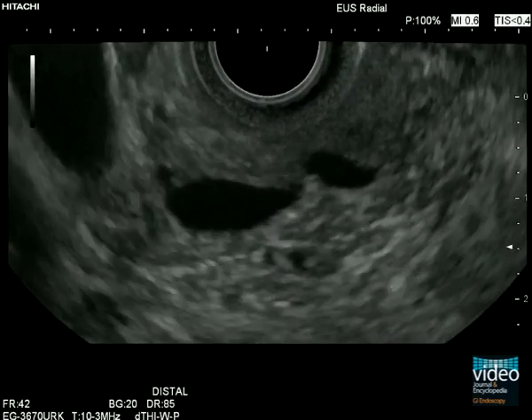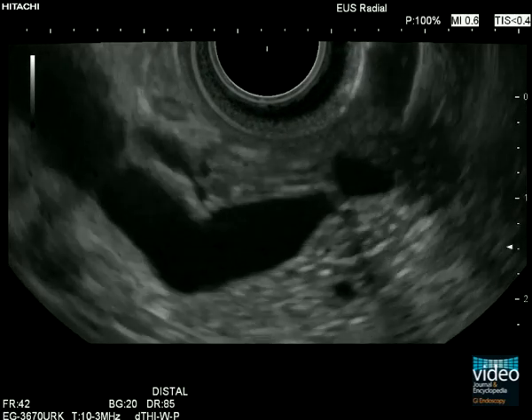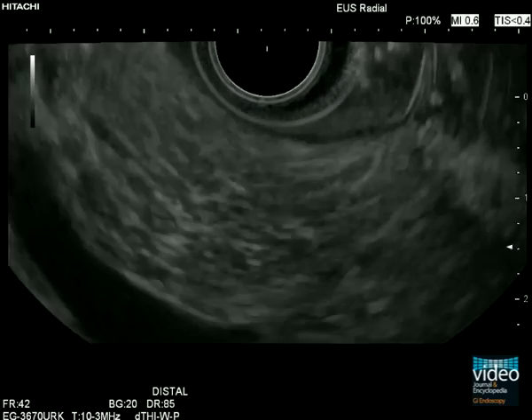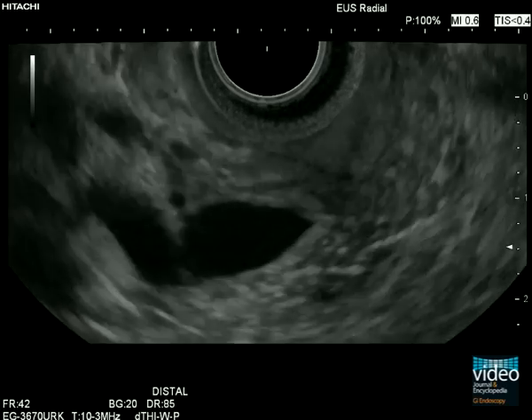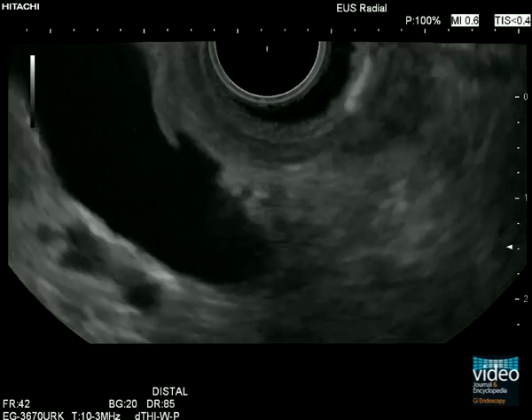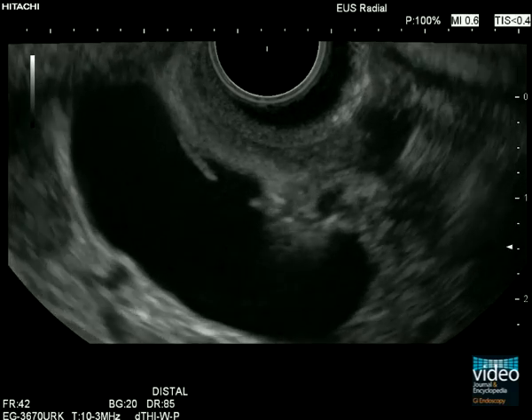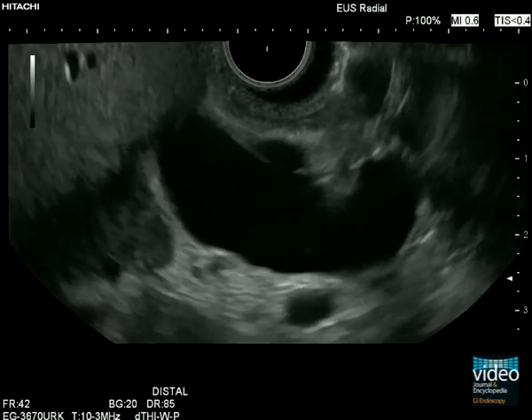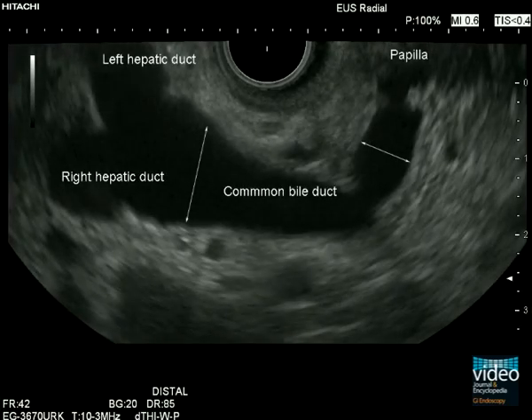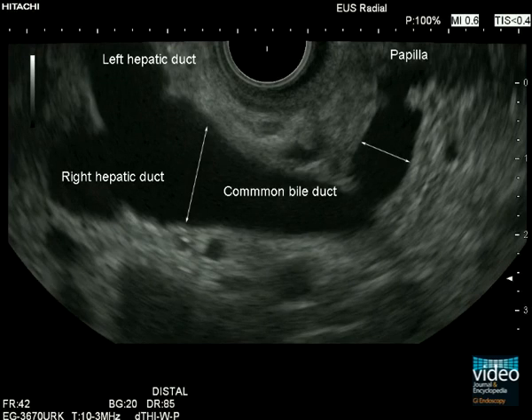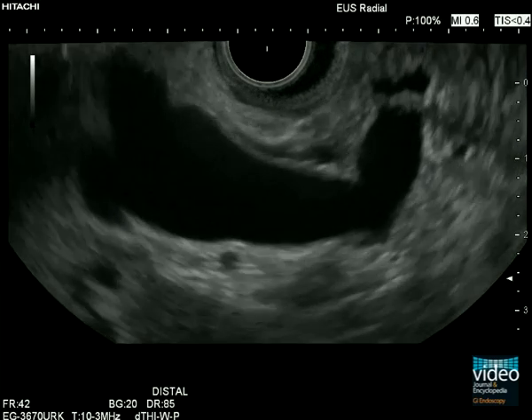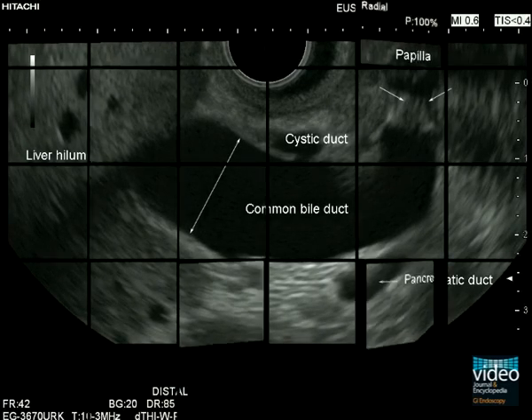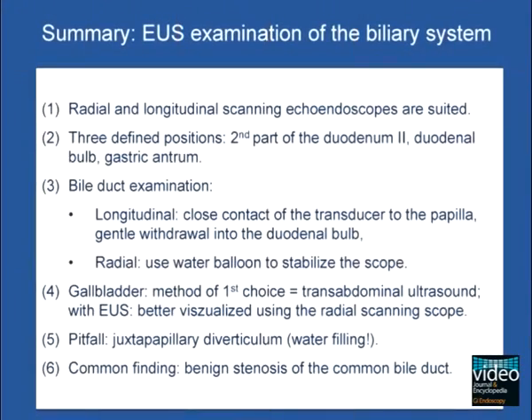This case again shows substantial dilatation of the bile duct in a patient 20 years after cholecystectomy suffering from recurrent attacks of upper abdominal pain. Using a radial scanning echoendoscope, the papilla is very well imaged. Careful examination detects neither a tumour nor stones. Contractions of the muscles of the major papilla may be observed. Endoscopic sphincterotomy and biopsy of the papilla are performed, showing a typical finding of adenomyomatosis.